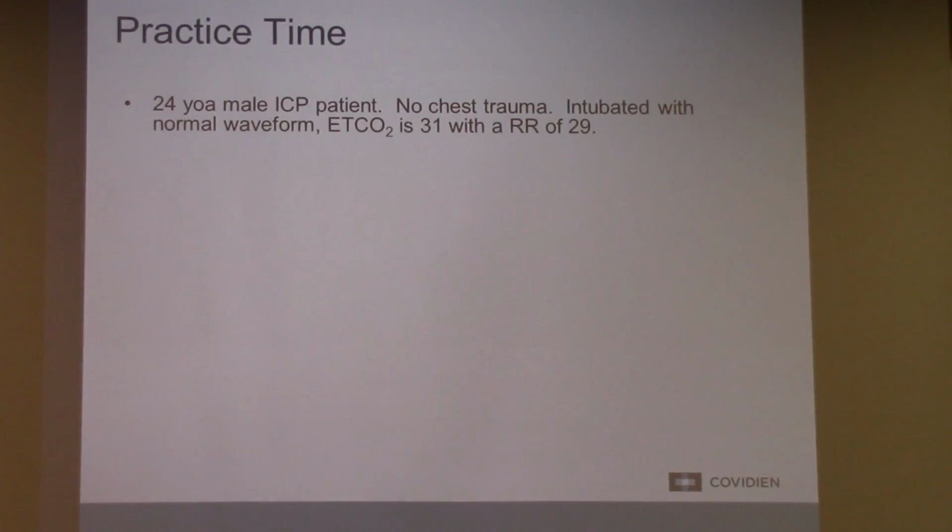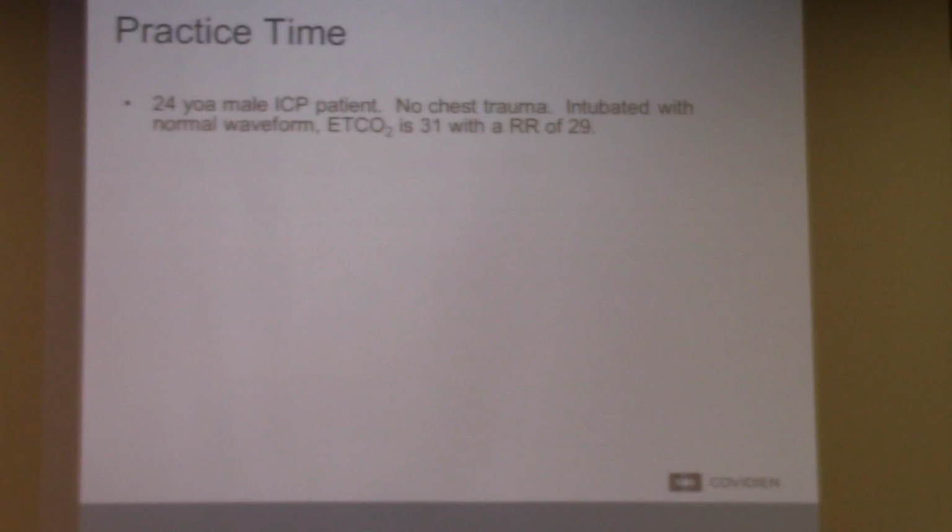Okay, ICP patients. So I had this patient, a pretty significant T-bone injury at a high rate of speed, probably got T-boned on the driver's side. He was the driver, probably at 60 miles an hour, on a literally dark, stormy, snowy night in West Denver. And we called for the bird, which abandons on landing, so we have the patient for about 40 minutes total to get him to the level 1 trauma center. Nasally intubate the patient, good waveform, so I know I'm in the right spot.